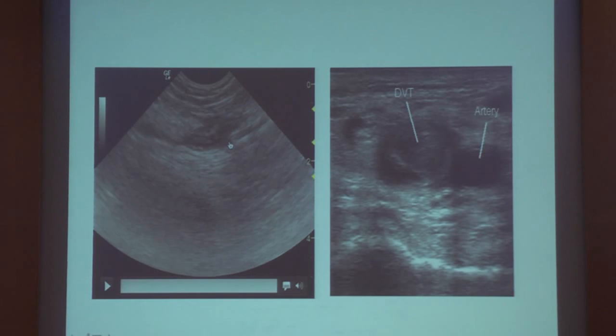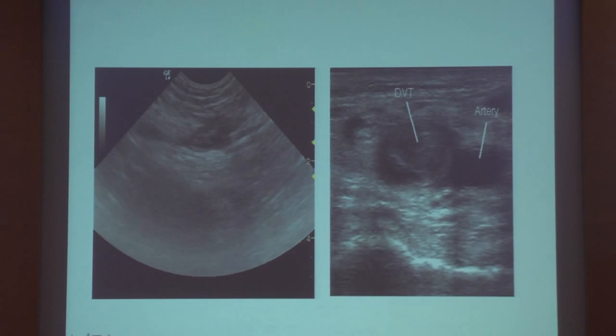Of course, you might argue that it may be an inguinal lymph node, which you might mistake. But that degree of expertise, of course, you should have. And if you see this, it means that it is DVT. And the treatment of DVT is the same as for pulmonary embolism. You need not investigate any further unless it is strongly indicated. And this is the same patient on the short axis view again. You can see a clot within the femoral vein. That is a femoral artery.